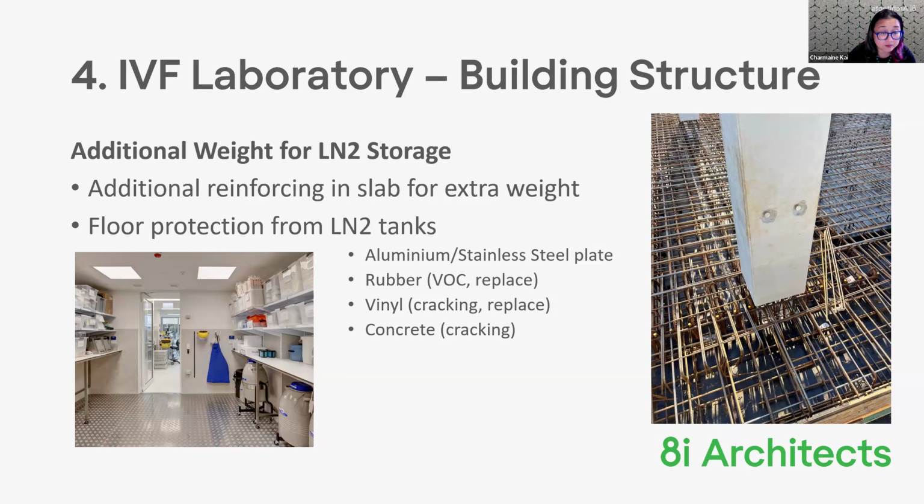I've seen a lot of tank rooms where it just has concrete. It is prone to cracking, just something to be aware of, because the cracks in the concrete actually create dust naturally. So if it's starting to crack, you'll actually get particulates within your tank room. So something to be aware of.